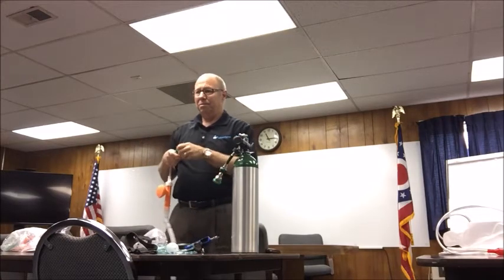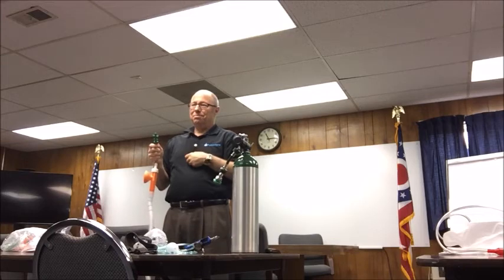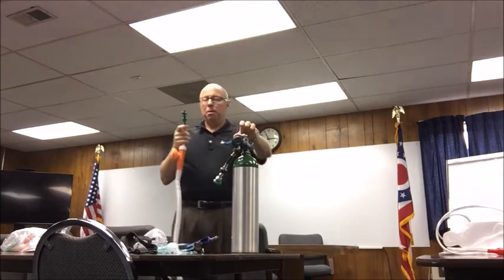I think they sent me one, and I used it, and then I got the wall, so I finally just, I don't know if it's right, but it worked. Yeah. All you do is twist it. And we can practice that here in a minute.